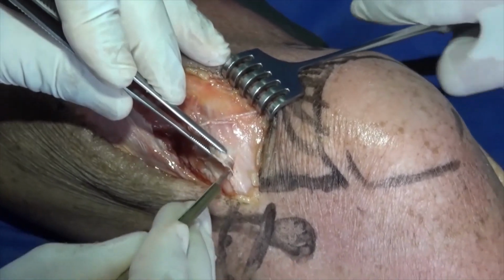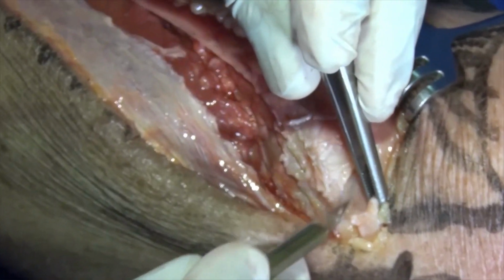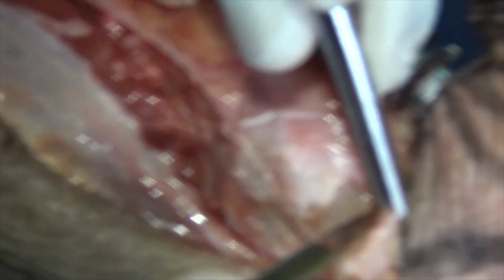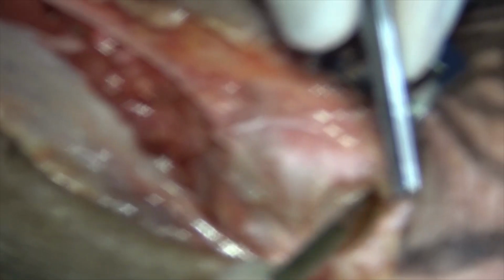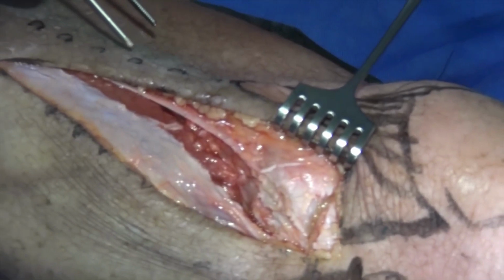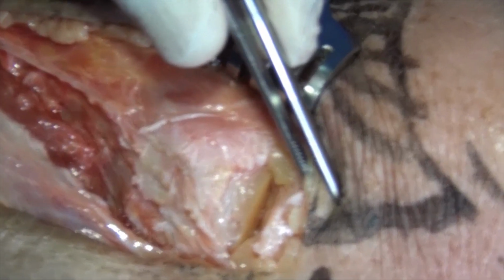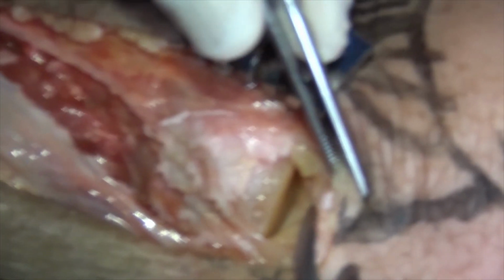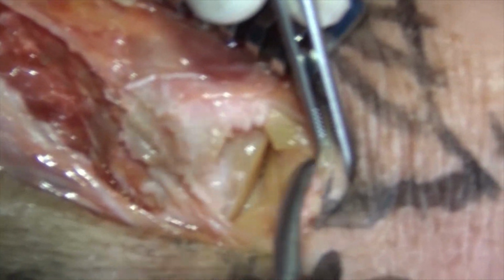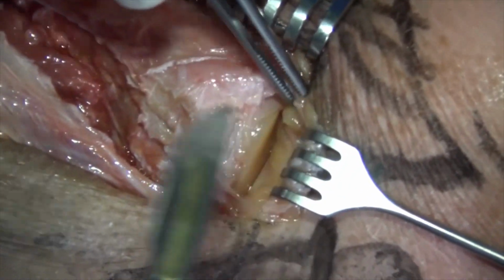You can then go underneath, lift up your meniscus. Do we have any sutures here? So you can see here, oh, right, sorry, okay. So you can see here, I'll just use this because we don't have sutures at the moment. So you can see inside the joint there. Yeah? So you just put sutures into the edge of the meniscus. You can go anteriorly as far as you wish.